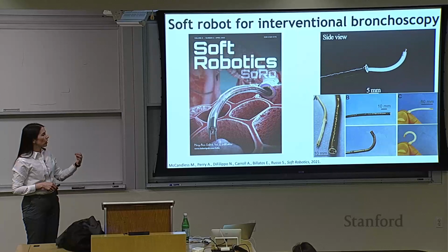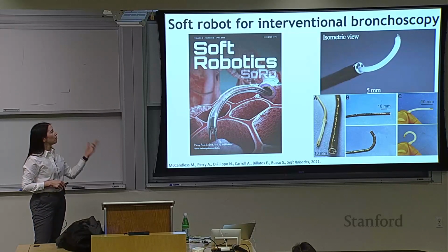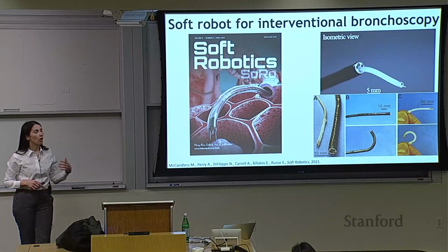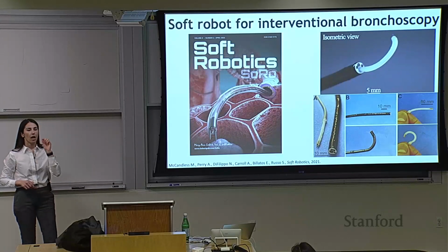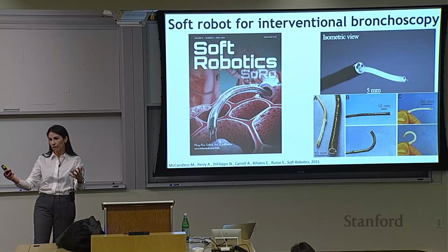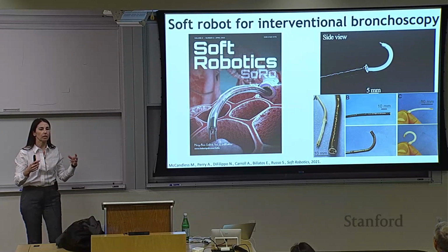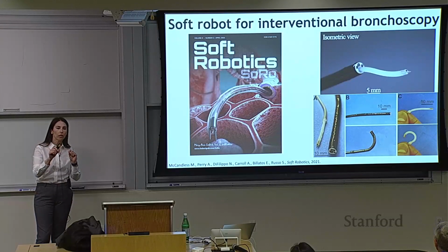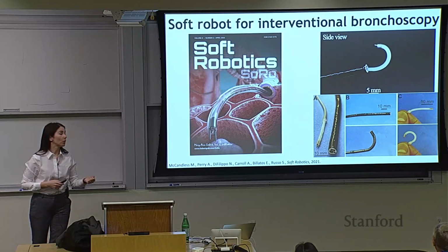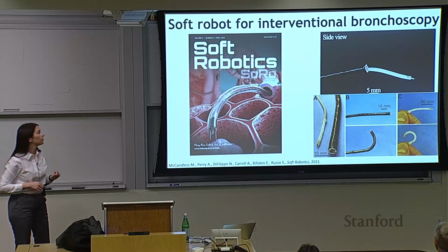And in this diameter, we were able to integrate 1 degree of freedom bending actuation mechanism, a micro camera, and 2 working channels. 2 working channels are beneficial because when you are at the surgical target area right here, and you start poking into the tissue and taking biopsies and so on, of course, you'll have blood, you'll have bleeding, and that, of course, gets in front of your camera. So having 2 working channels basically restores that ability of doing multiple tasks. And so as you're poking the tissue, you can probably clean up the camera, aspirate, and do something more useful without having to pass instruments back and forth and switch instruments with only 1 working channel.